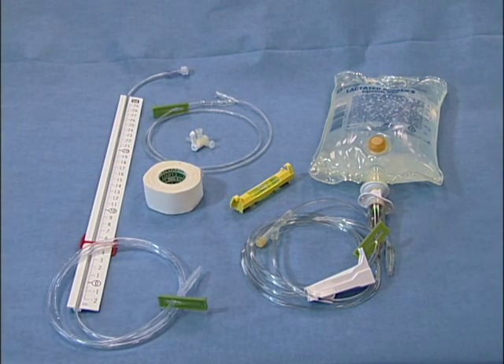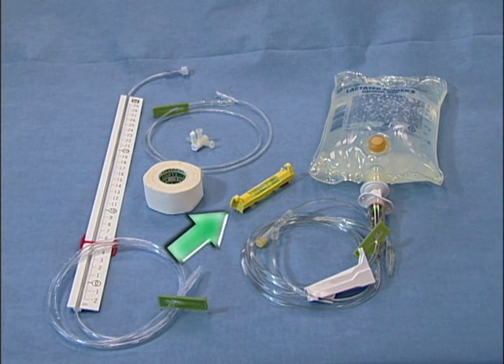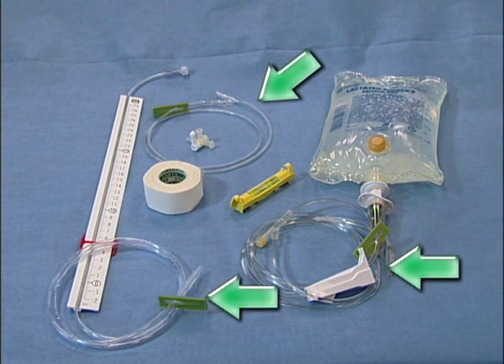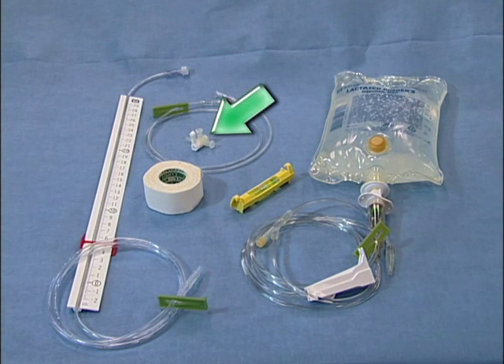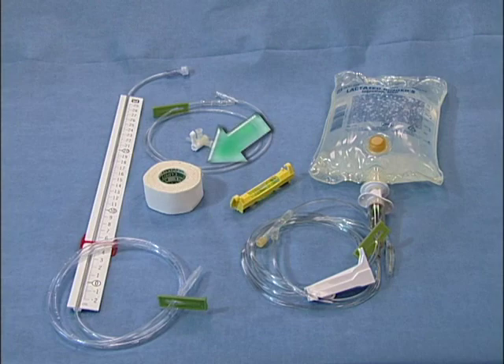This is the equipment that will be needed to monitor central venous pressure: a simple water manometer, a line level, extension tubing, a three-way stopcock, IV fluids with administration set, and white tape.